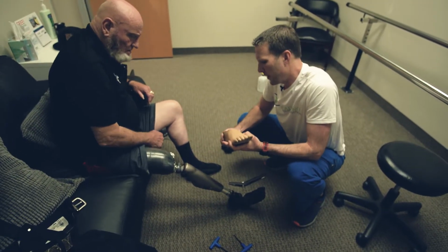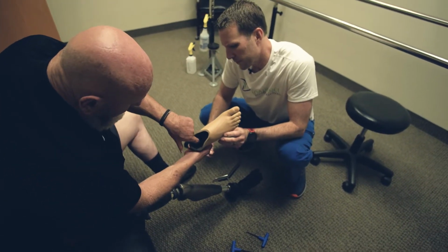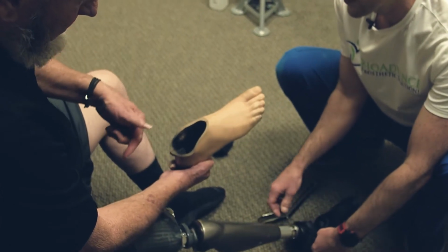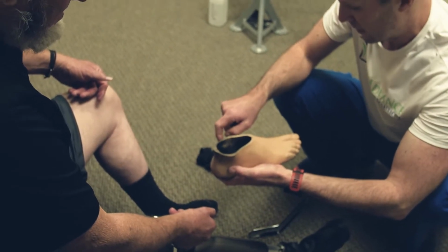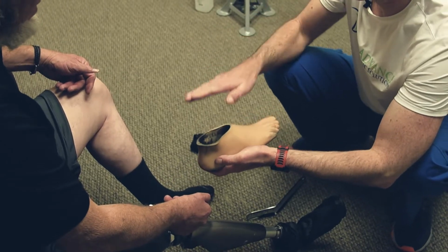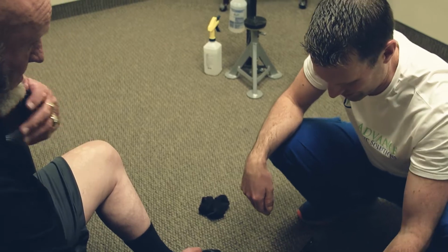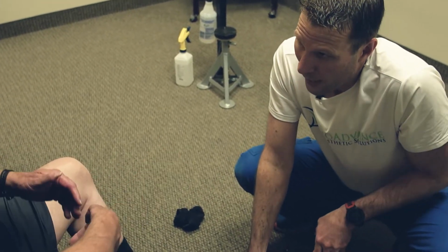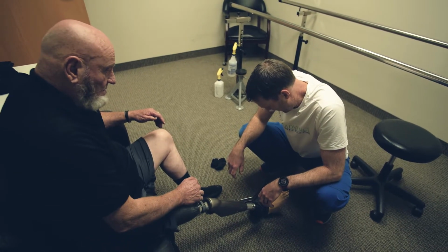So you see that lip in there? Yeah. And the back of that carbon heel piece goes up underneath it. So what you want to make sure is that it gets clipped underneath there. Because if you don't, you'll ride up on top of that, and it's going to pitch you forward, and every time you step down, it's going to feel like a shock absorption under you, like there's a spring. And if you don't get it on, you kind of have to pull it back and let that go under that ridge there. I may send you a foot shell.